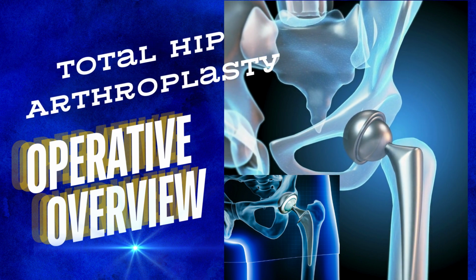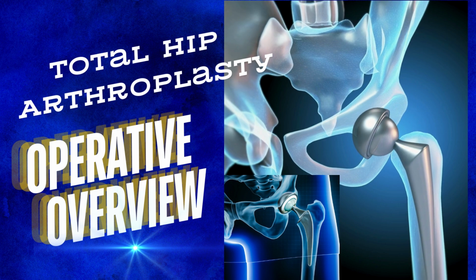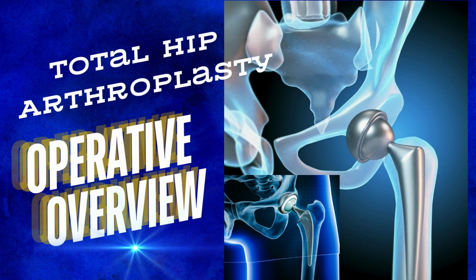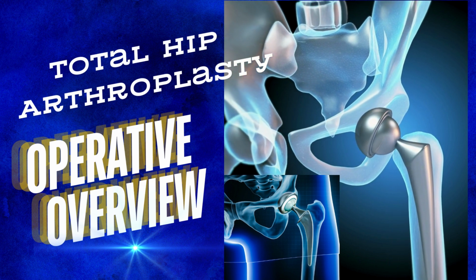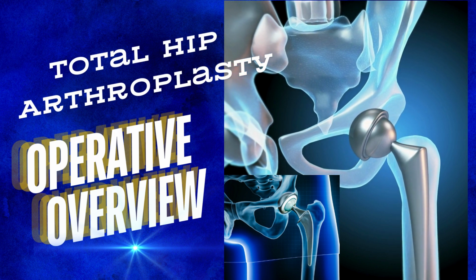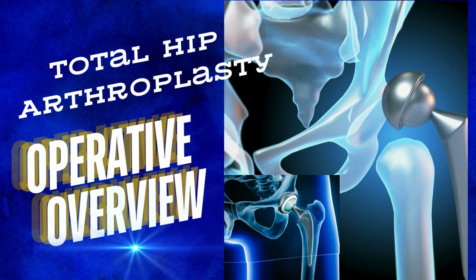Total hip replacement is a surgical procedure in which the damaged cartilage and bone is removed from the hip joint and replaced with artificial components. Total hip replacement is performed in the operating room after you are given general or regional anesthesia.